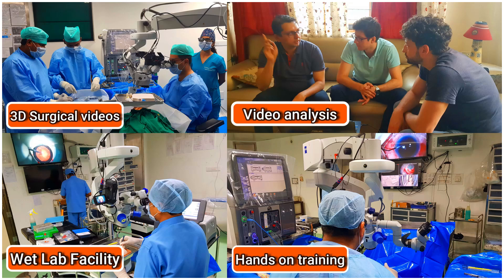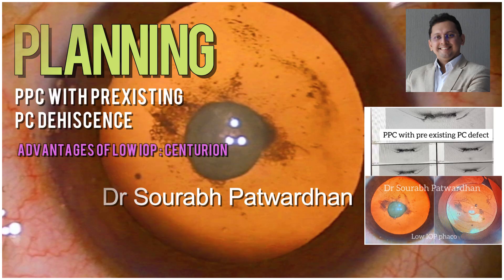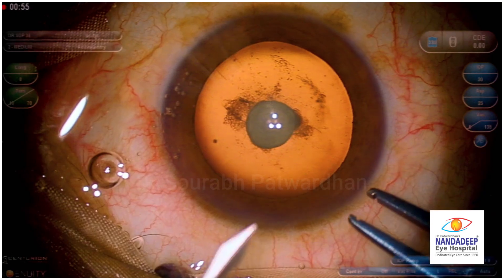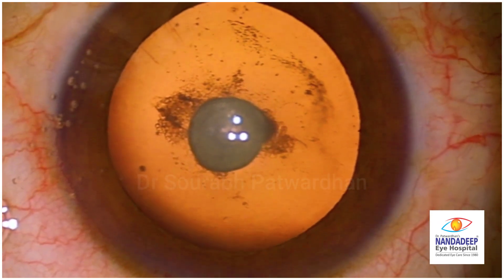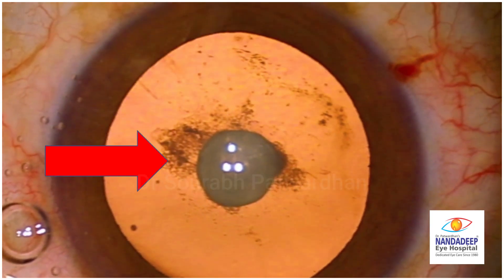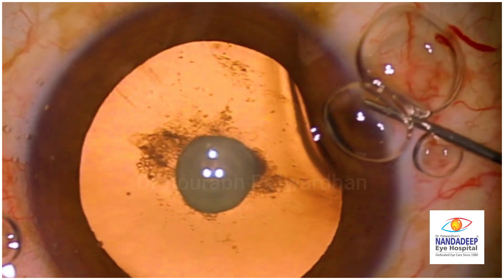In our center we have a lot of teaching activities which includes hands-on training as well. In this video I am sharing an interesting case with posterior polar cataract and there was a pre-existing PC dehiscence which can be seen on this OCT. You can see that the posterior capsule is already dehiscent in the central part, so there is a risk of nucleus drop if we don't take all the precautions. You can also see those opacities in the anterior vitreous behind the posterior capsule, which indicates that from that dehiscent PC there is always some leakage of lens matter into the anterior vitreous. So the plan here is to do a low IOP FECO, and that's the area where you can also see the dehiscent capsule, already ready to extend.